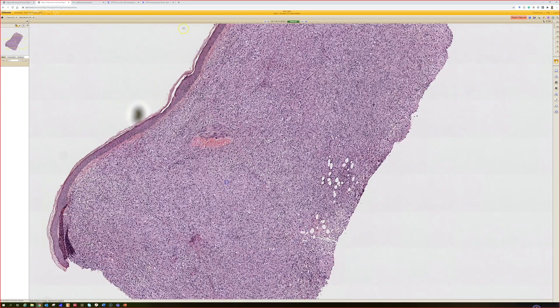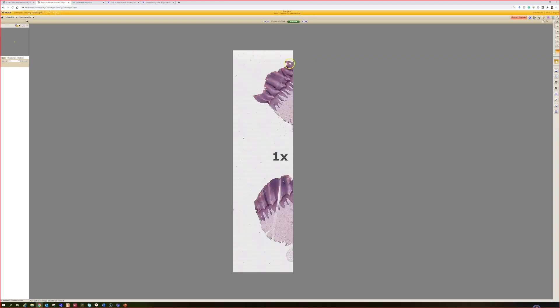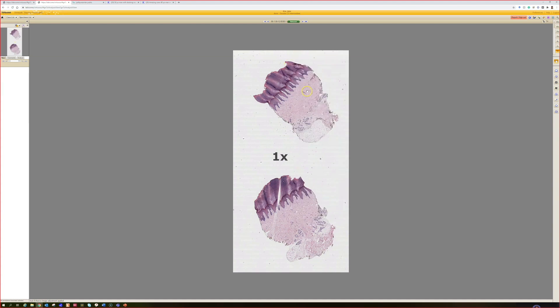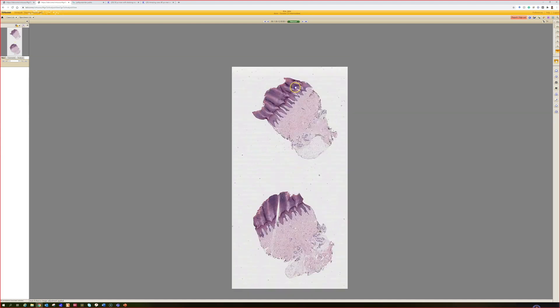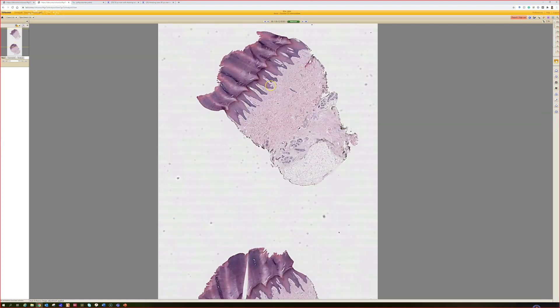So this is lepromatous leprosy, and of course there's all this borderline lepromatous — I've always found that much more complicated, and it really depends on the clinical situation.